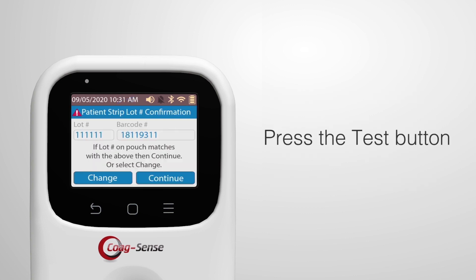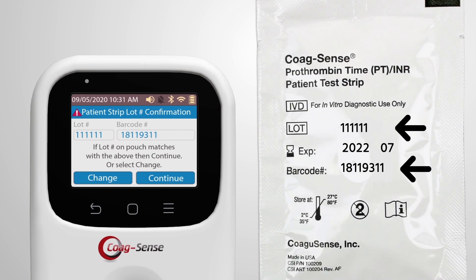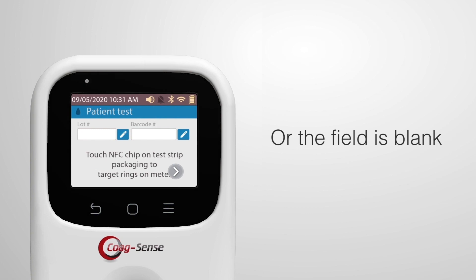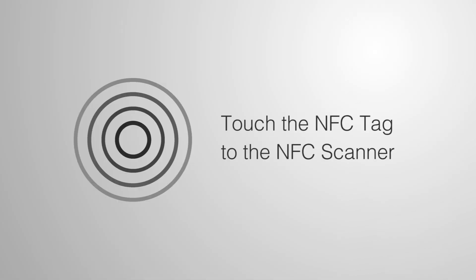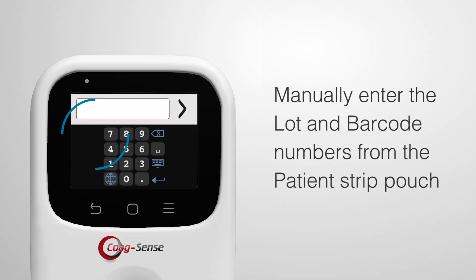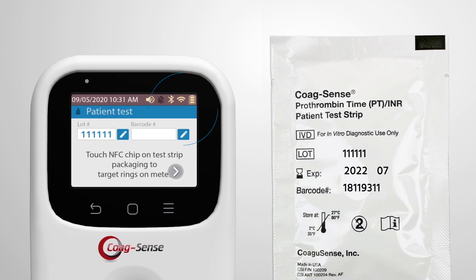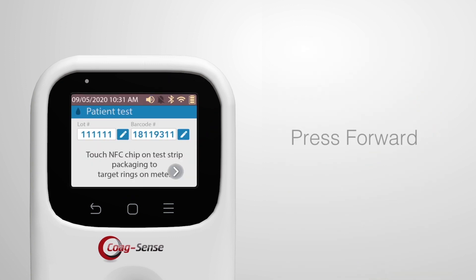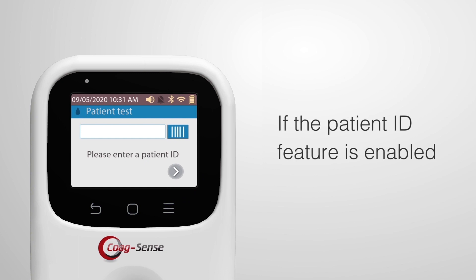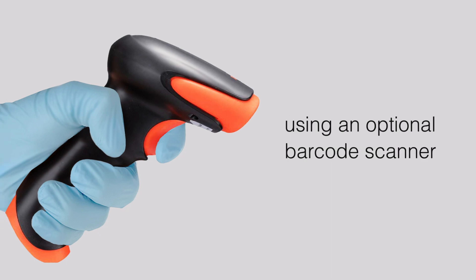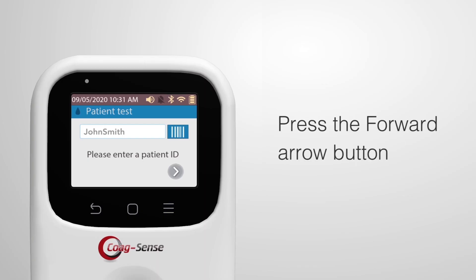Press the test button on the color touch screen. Confirm that the patient strip lot number and barcode number displayed match the information on the test strip pouch. If the number does not match or the field is blank, touch the NFC tag to the NFC scanner on the meter. If the NFC tag is not available, manually enter the lot and barcode numbers from the patient test strip pouch. Then press the forward button. If the patient ID feature is enabled, enter the patient ID or scan the patient ID barcode using an optional barcode scanner, then press the forward arrow button.